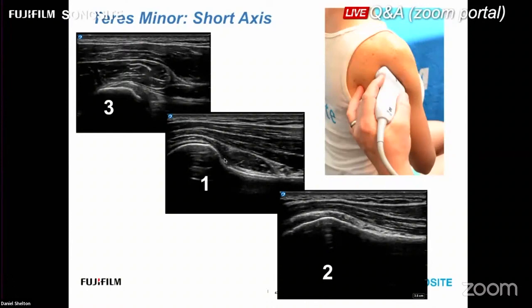Here we have the deltoid overlying this, and then up here the infraspinatus, most inferior margin. And then from there, you just want to translate the entire transducer either towards the scapula, which you'll catch the inferior margin of the glenoid here, and then come back to your home base of the humeral head neck junction posteriorly, and then slide laterally to catch that inferior facet.